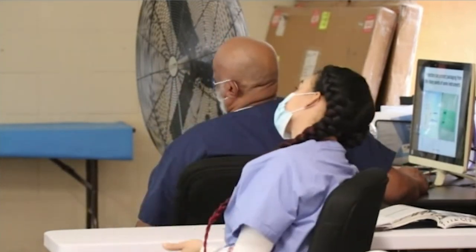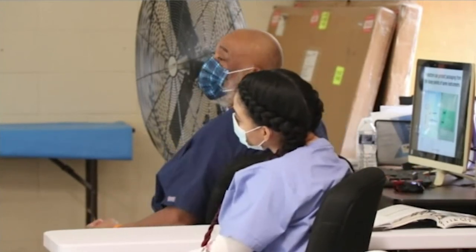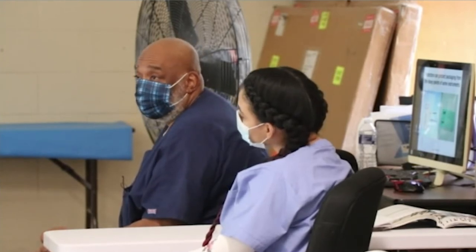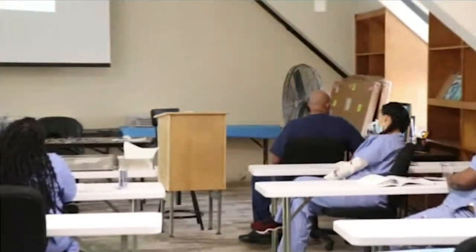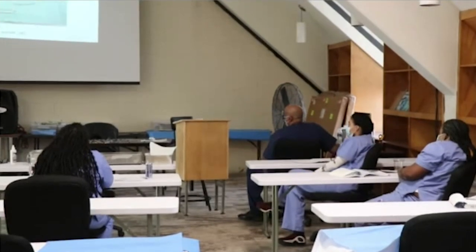These are used sometimes. I've used them. They're foam, and the reason why we try to stay away from foam so much is because they maintain moisture. Remember I was telling you guys about the corner protectors? Some hospitals still use foam, but for the most part now they use the plastic. The corner protectors are there to make sure that we don't get holes in our wrapped instruments. Questions so far for me? You guys are doing great.